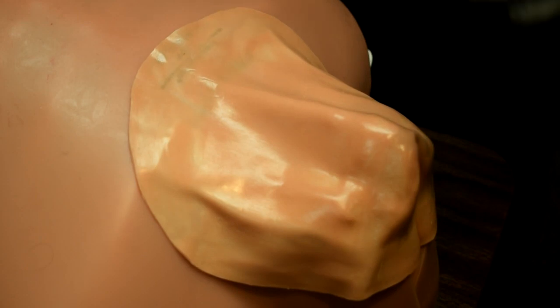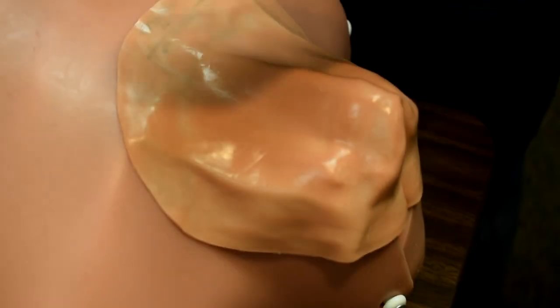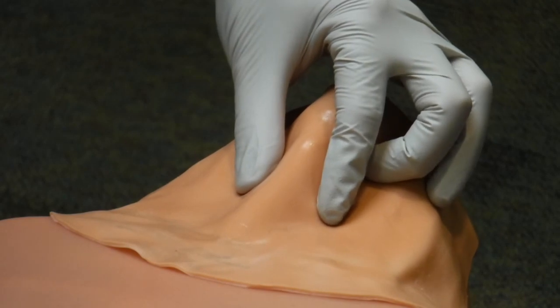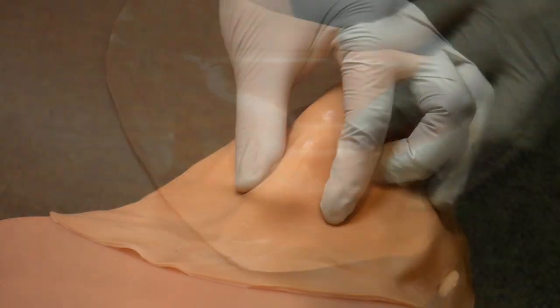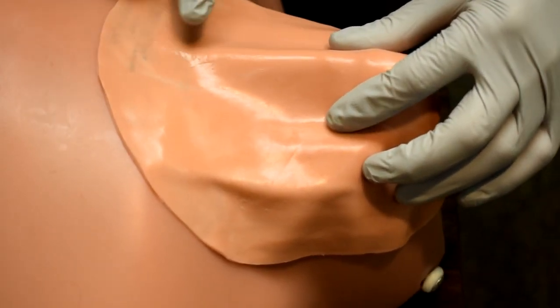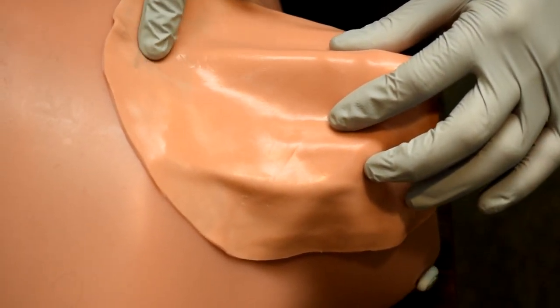So as we stand to the right side of the patient, I'm going to use my left hand to stabilize the airway and also help me to identify anatomy. So as a review, when we're feeling the anatomy on the neck, it's easy to start at the bottom and feel the sternal notch.